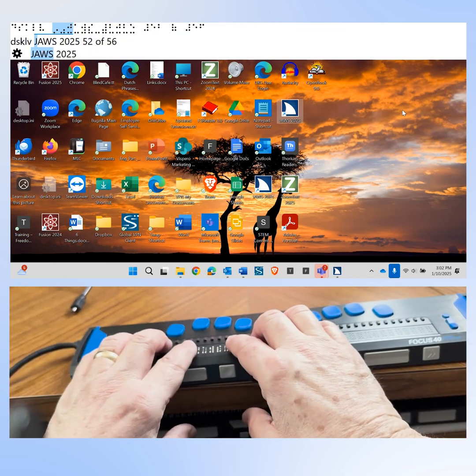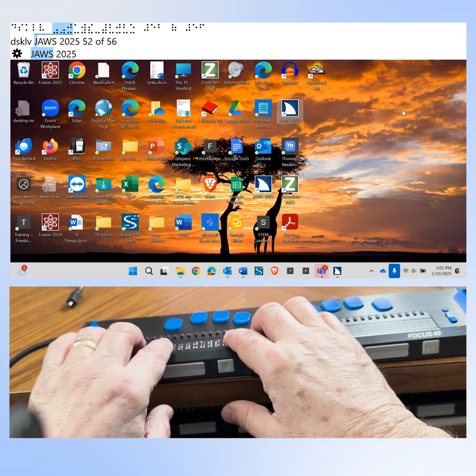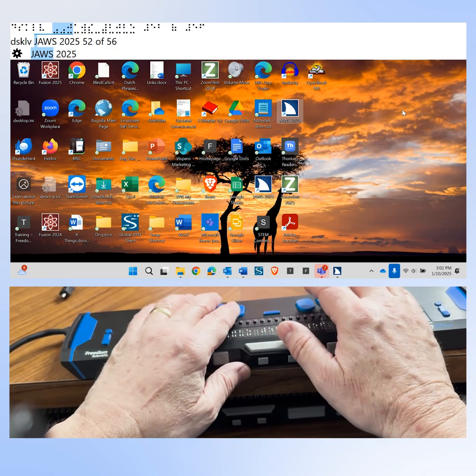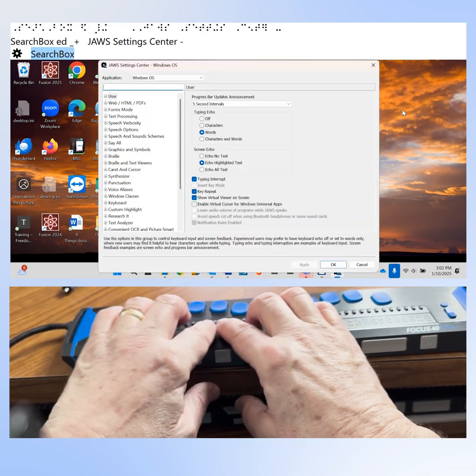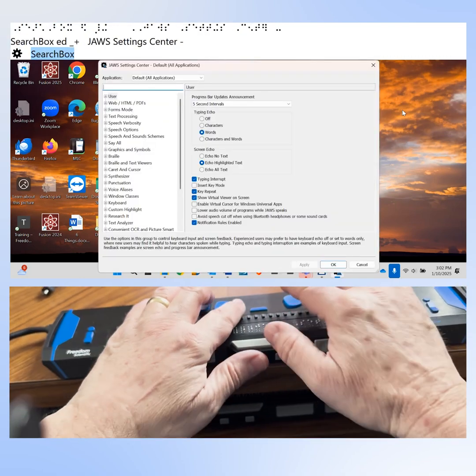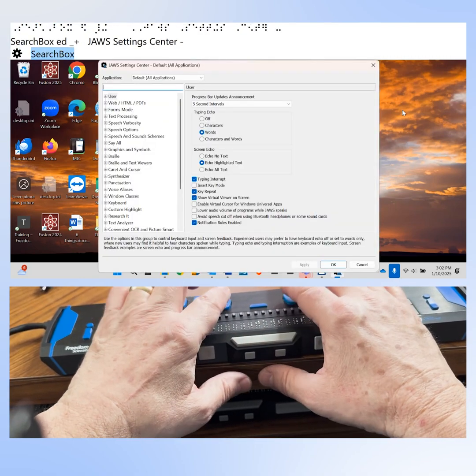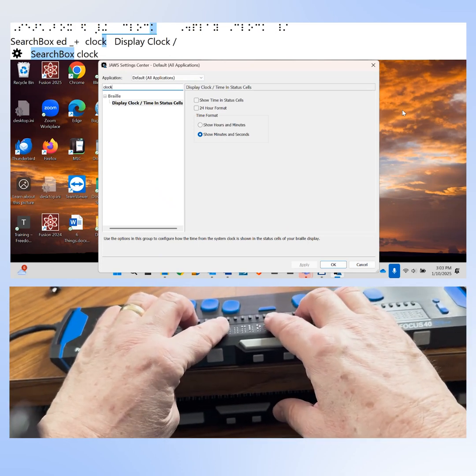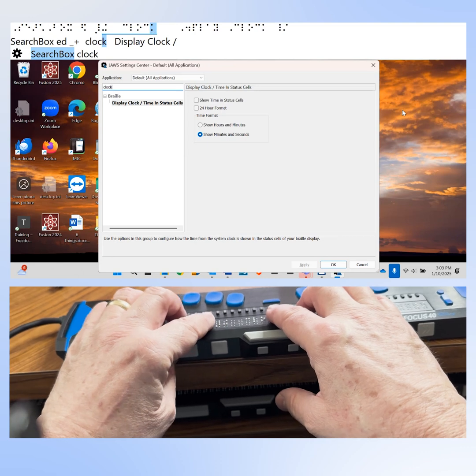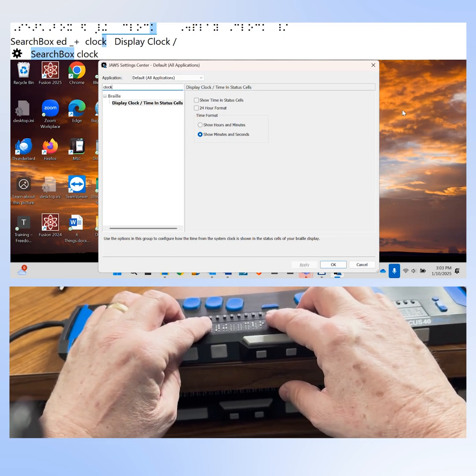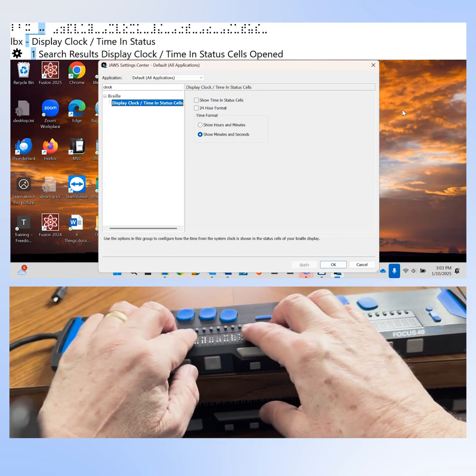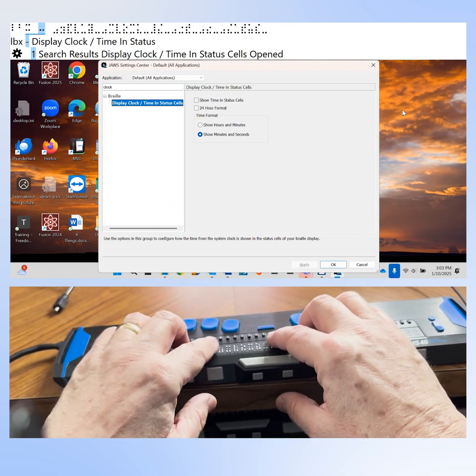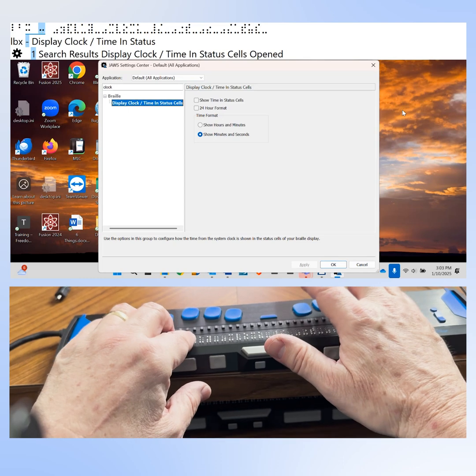In order to turn the clock view on in your status cells, you'll need to first go to JAWS Settings Center by pressing Insert and NumRow 6. Now let's enter "clock" into the search edit field. Display clock/time in status cells comes up as one search result. We have to press down arrow — I'll press the rocker bar down on the front panel of the braille display — then press Enter to move focus to this option in the tree view.